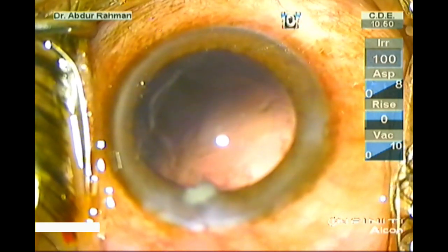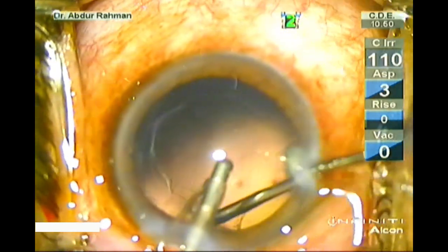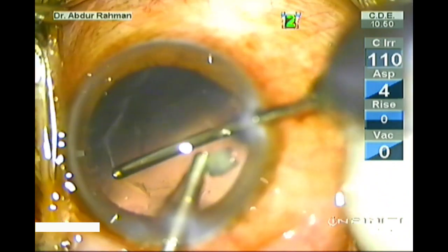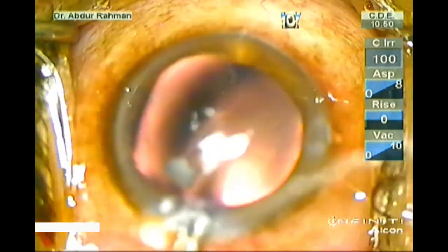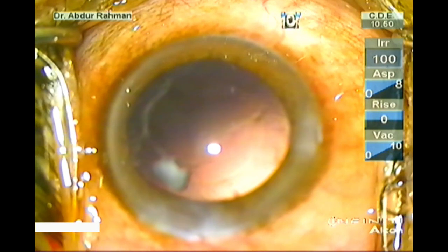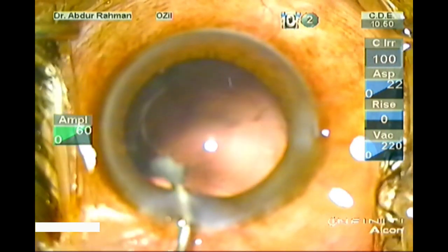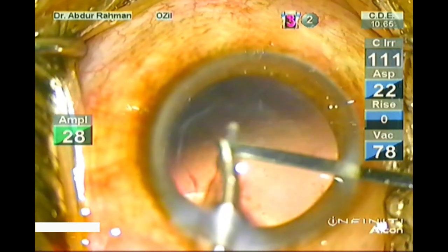Now I will perform a modified form of bimanual cortical removal, where irrigation is happening through the coaxial handpiece and aspiration is happening through the bimanual aspiration handpiece. In doing so, I was able to remove the sub-incisional cortex. This small last piece is emulsified with the phaco handpiece in epinucleus mode — I removed it.